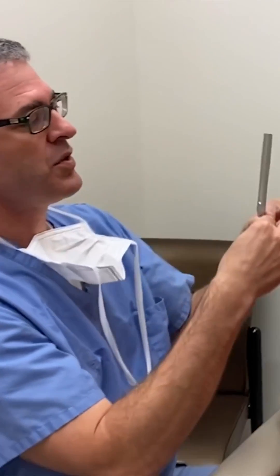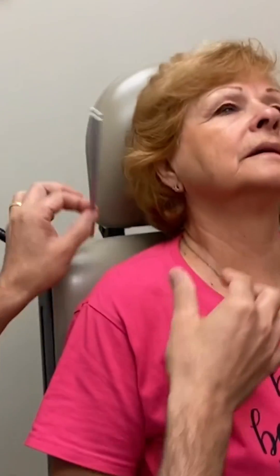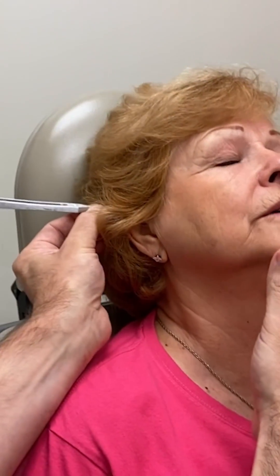Now for the Rinne test — is air conduction position one or position two greater? Two. So that just kind of confirms our suspicion that she has ear fluid.